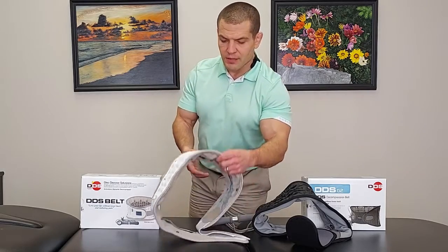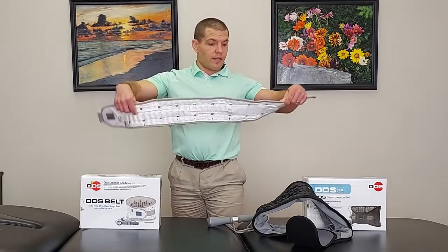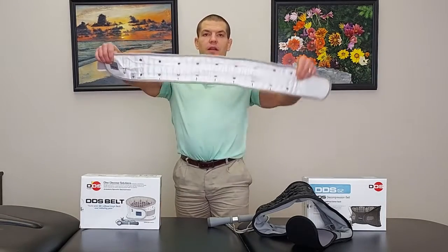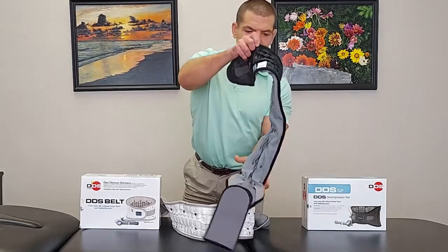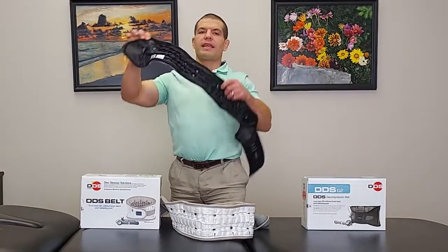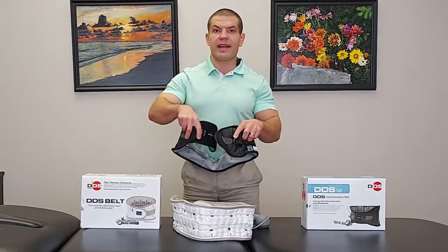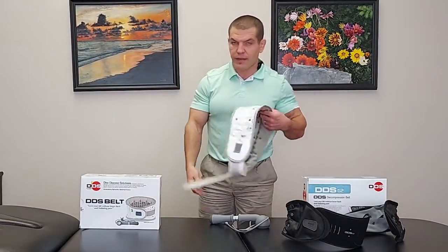Looking at the two braces, the DDS-300 is tapered from the back coming along the side — it gets a little narrower going down from side to side. The G2, on the other hand, is pretty much the same thickness throughout from back to sides, actually getting a little thicker on the sides, and has a Velcro strap in front where it gets very narrow when fastened together.